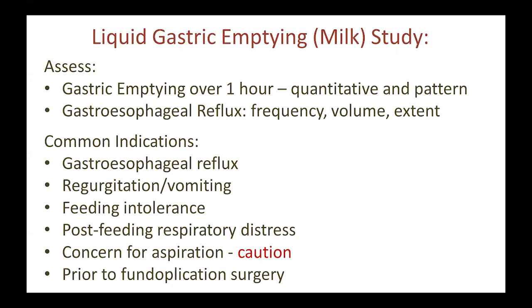Common indications for this study include patients in whom there is clinical concern for reflux, patients who have demonstrated regurgitation or vomiting, increasing feeding intolerance, post-feeding respiratory distress and concern for aspiration, although sometimes caution is appropriate as we don't want to have an episode of aspiration in the nuclear medicine department. And then patients who are going to have fundoplication surgery for reflux frequently undergo a milk study to confirm that there's normal anterograde emptying of the stomach.